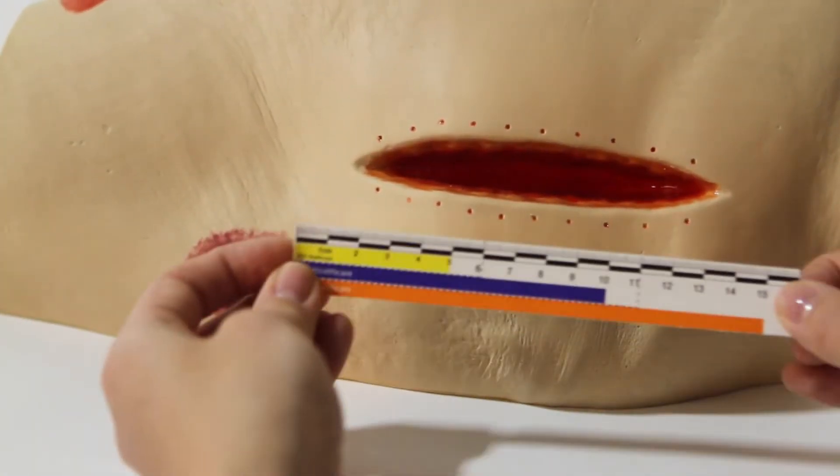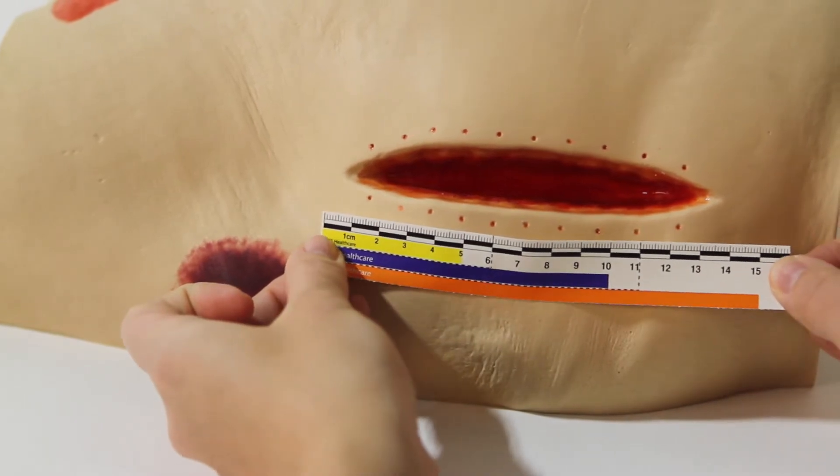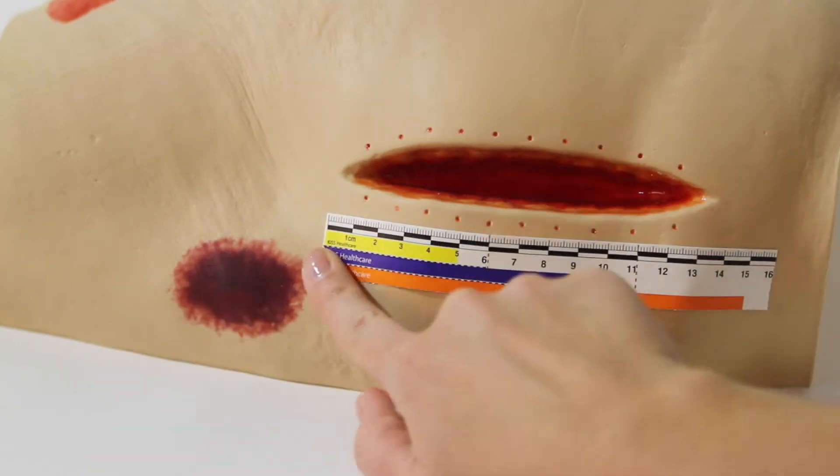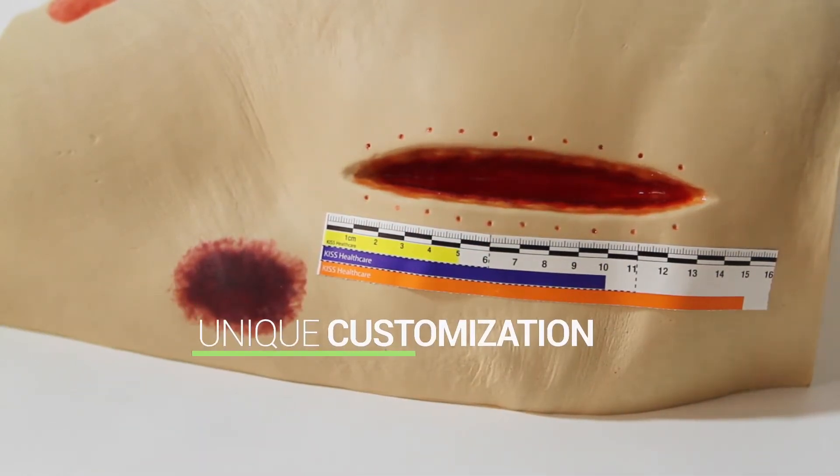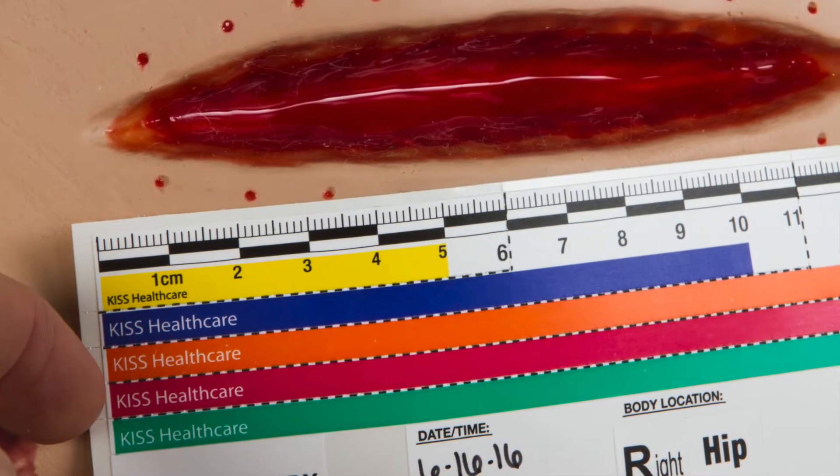The KISS system wound ruler is great for linear and larger wounds. The custom color-coded ruler is perforated and easy to use. The multiple perforated edges allow for unique customization to best fit the size of the wound. First, select a ruler size that is slightly larger than the wound.